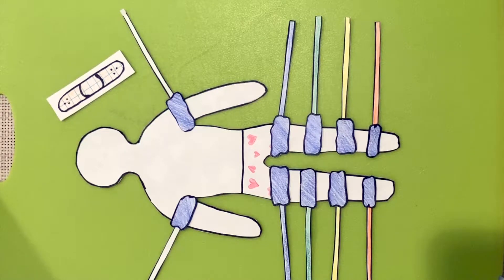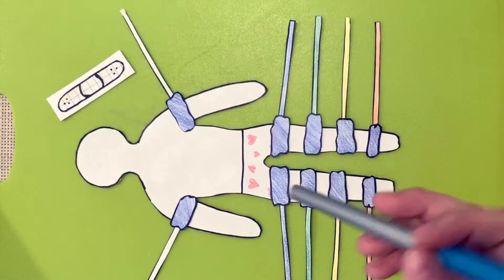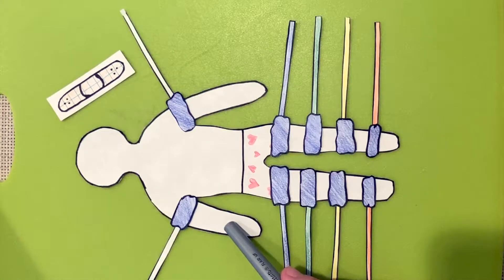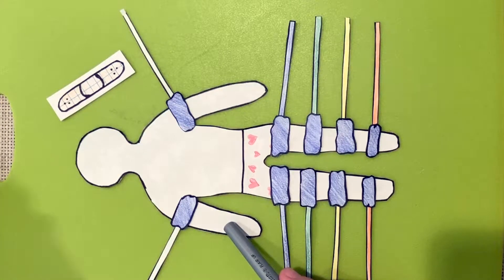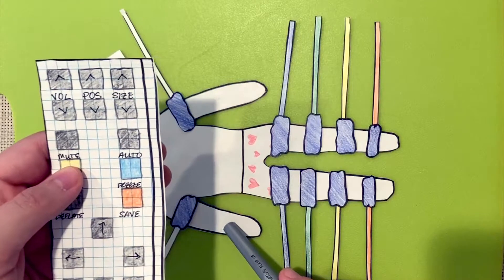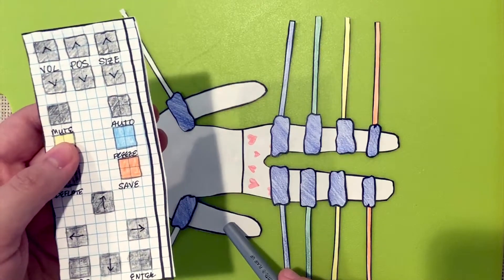With the continuous wave pencil probe, you will locate the radial artery in the arm. Once you have a strong waveform, you will use the remote to inflate the cuff. Hold the inflate button until the signal is gone and then release.